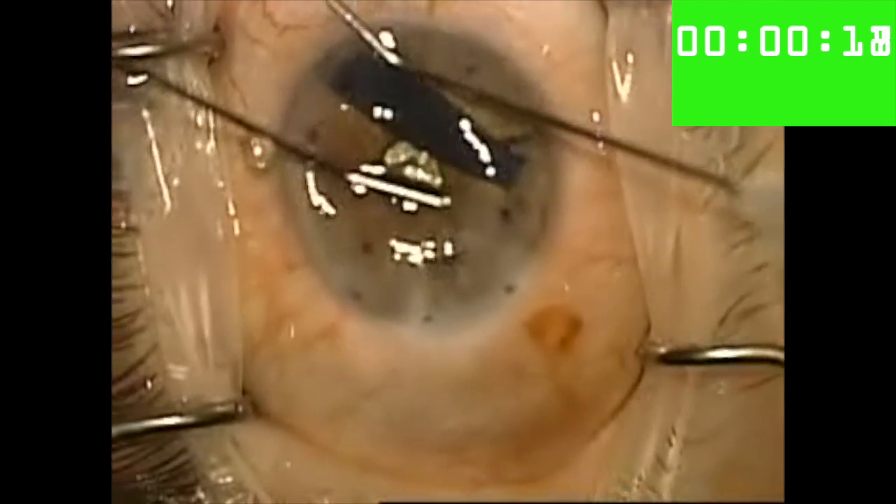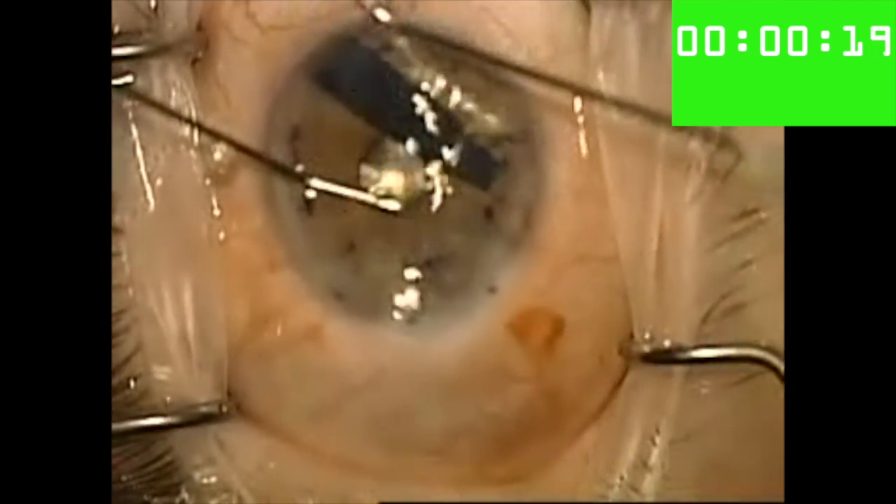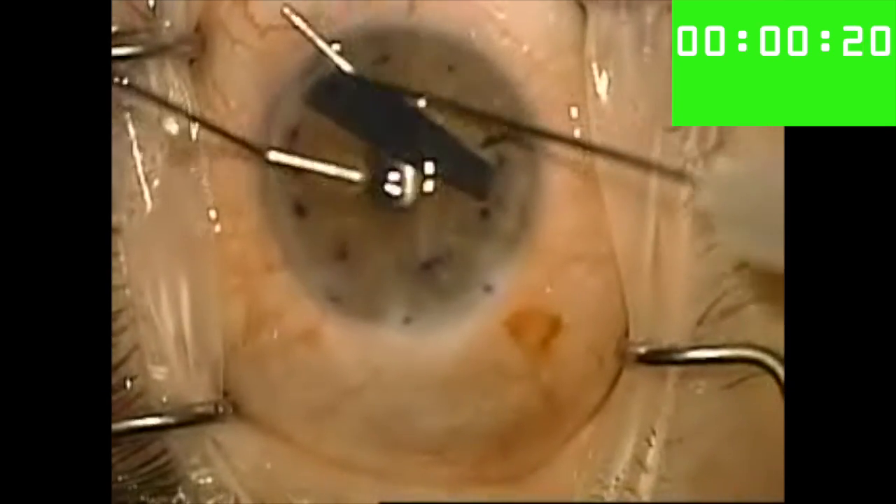Mike Stryka has shown me that this technique can be even more effective if you tap perpendicular to the scroll's spine rather than parallel to it, as I'm doing here.